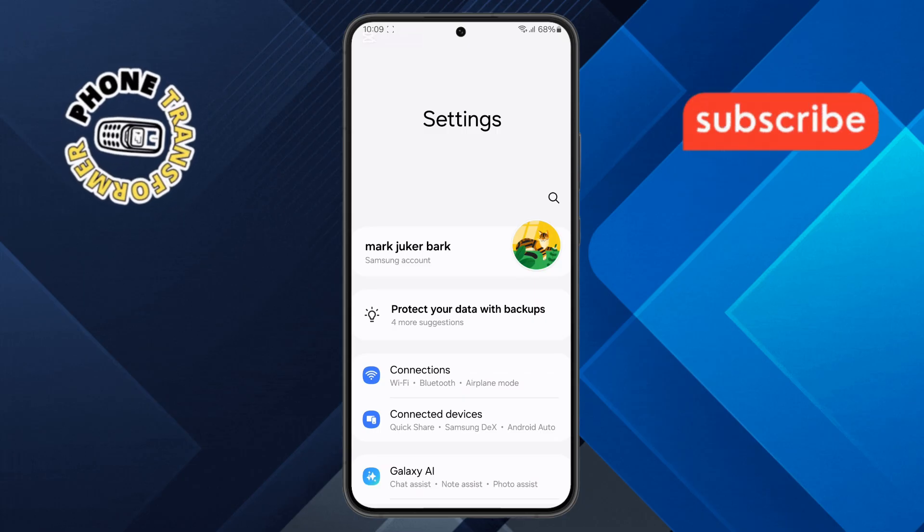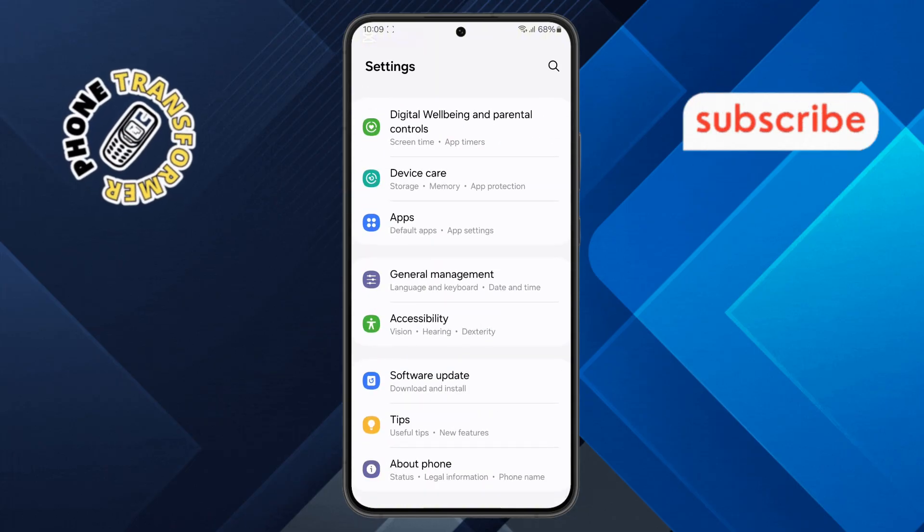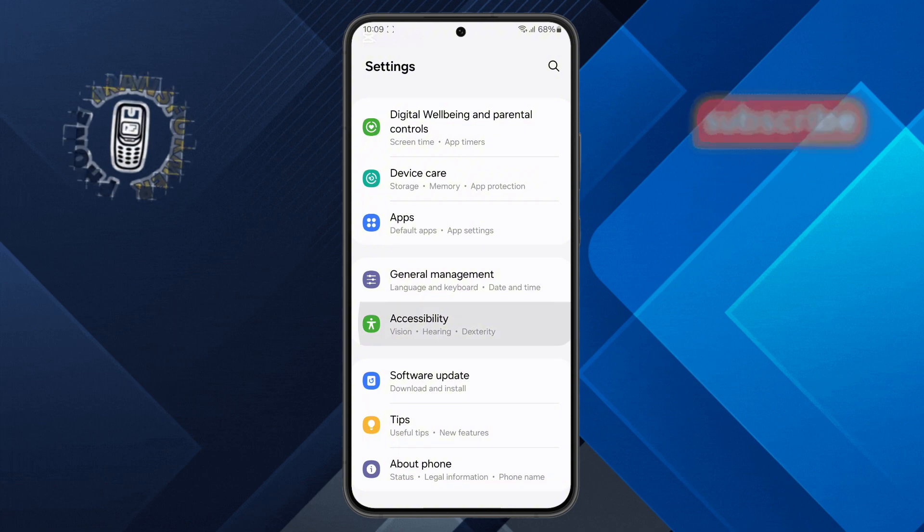Step 2. Next, in the Settings menu, scroll down until you find the Accessibility option. This section is designed to help users with different needs, including those using hearing aids. Once you find it, tap on it to open the menu.